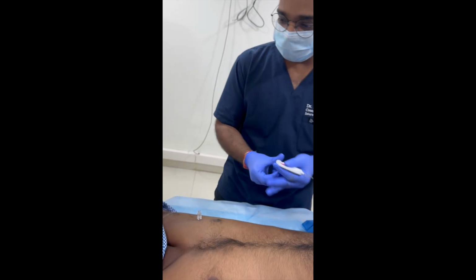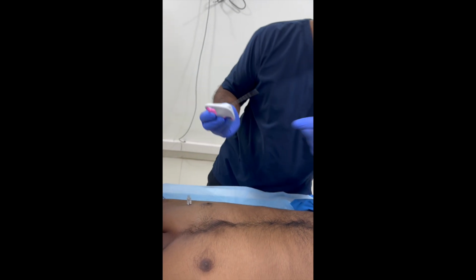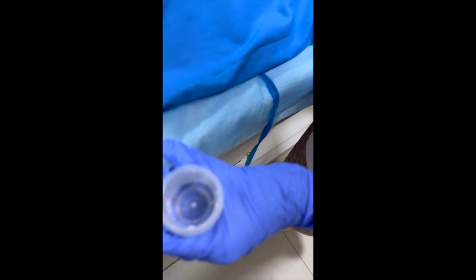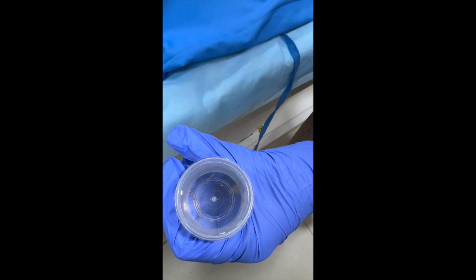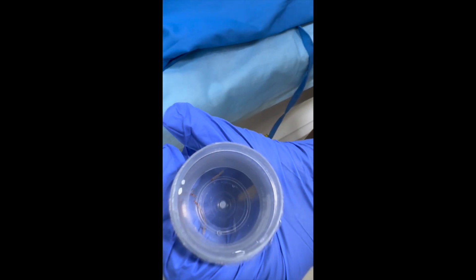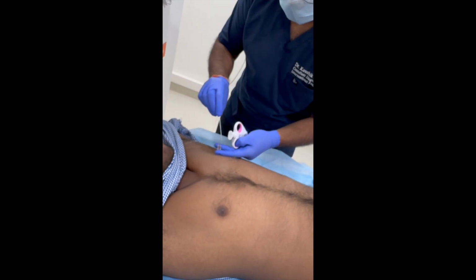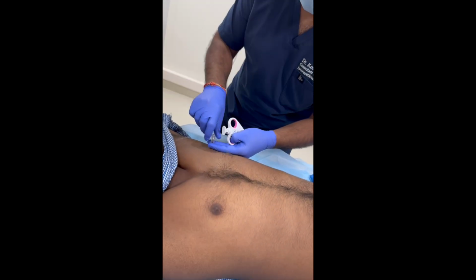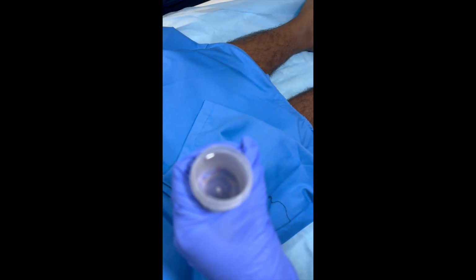Here you can see the biopsy samples I have acquired. Usually you get biopsy pieces 2 centimeters in length. Here is the third sample.